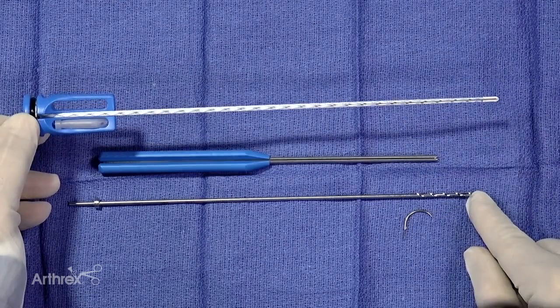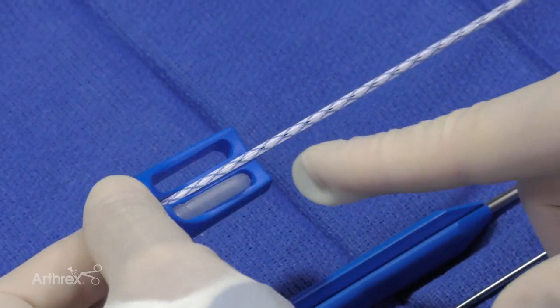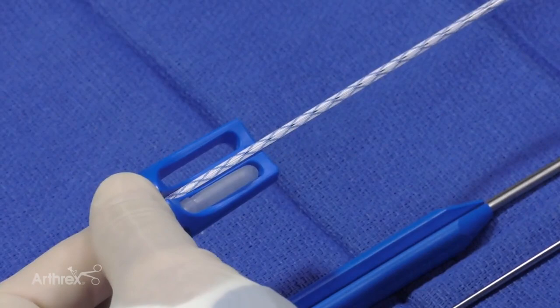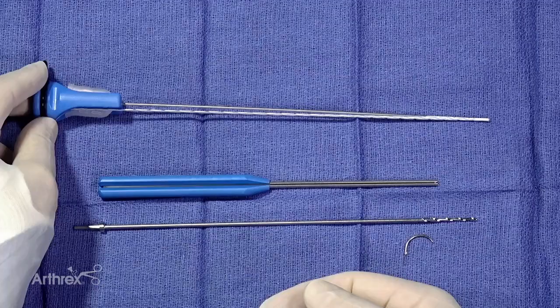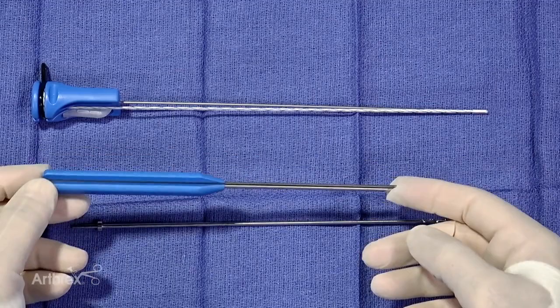So the opposite cortex, for example, in the proximal humerus is irrelevant. You just got to get through the first cortex. The suture tapes have swedged on needles for convenience. And the overall length of the tape is much shorter to improve its flexibility and handling properties. Because we're advocating doing this in a single step, we now have a slotted guide that we will drill through, insert the anchor, and extract the guide, and then be able to work with the sutures that have needles swedged on.